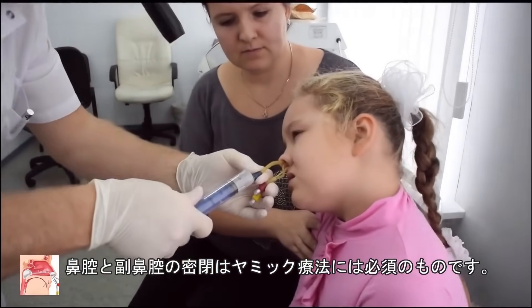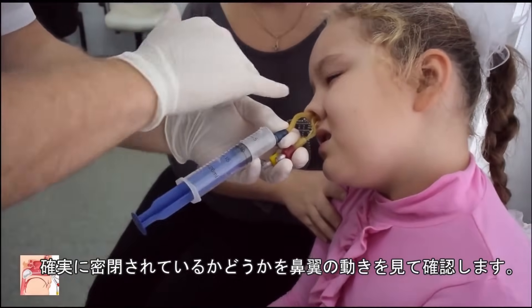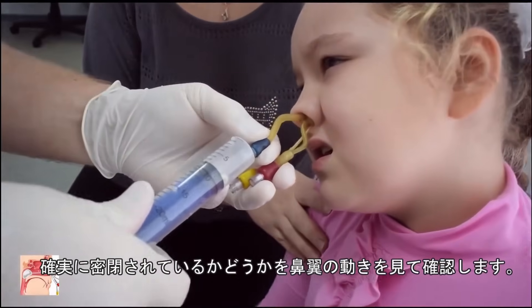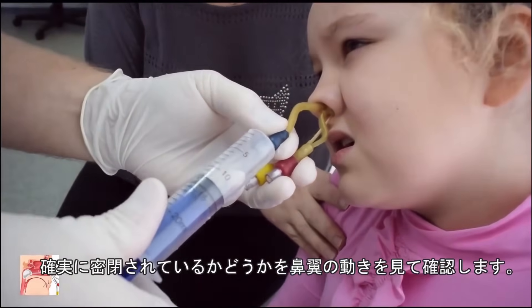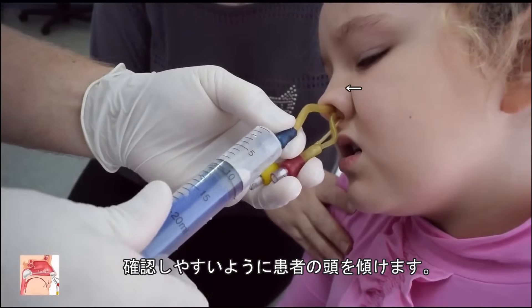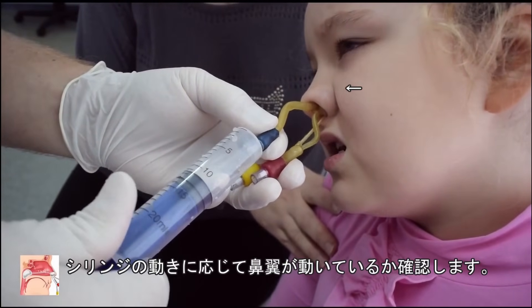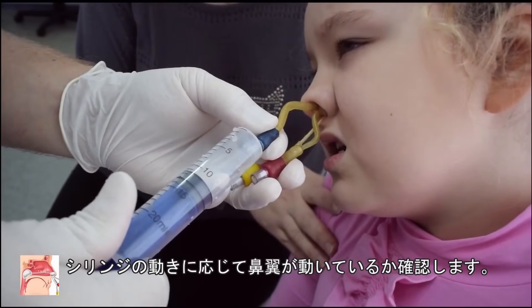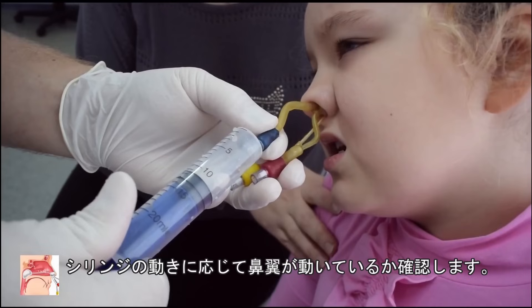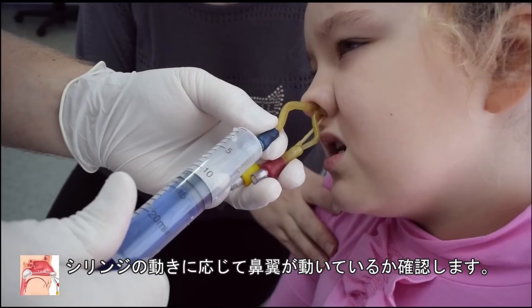Sealing is mandatory for the YAMIC procedure. In order to provide good visibility of nose-wing movement for the physician, the patient's head should be tilted during the seal check. When the syringe plunger is pulled, the nose-wing should be drawn in and returned to the initial position, synchronous to the plunger movement.